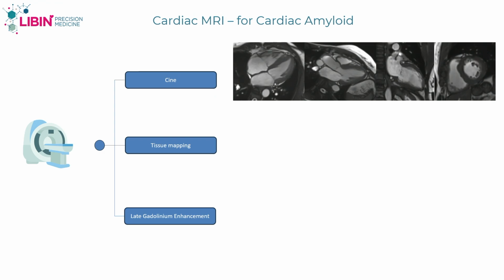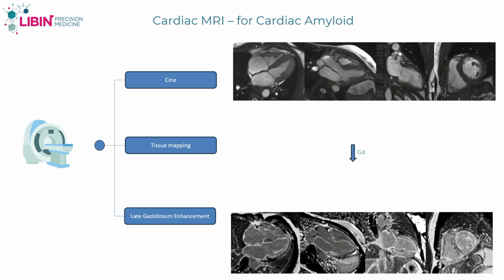And we can look at the heart chambers to see if they're increased in thickness, whether there's contractile dysfunction. And we can get a lot of information about things like heart valves as well. But the real advantages of MRI is that we can give contrast, and there's both intrinsic contrast and exogenous contrast. We'll talk about that in a second.